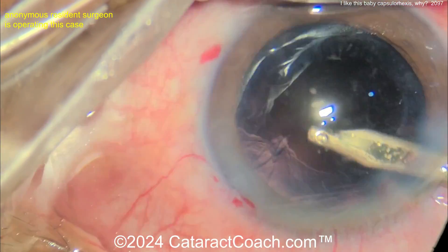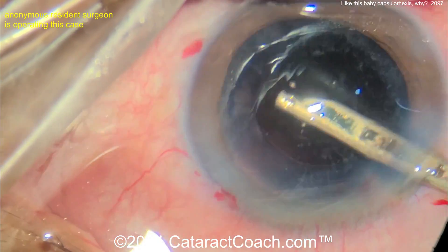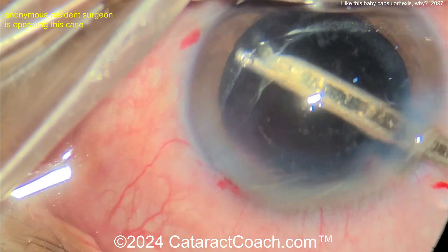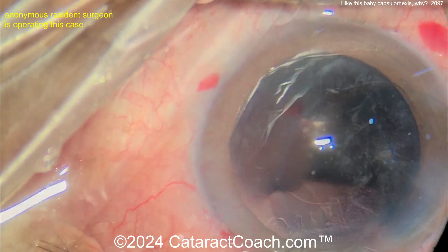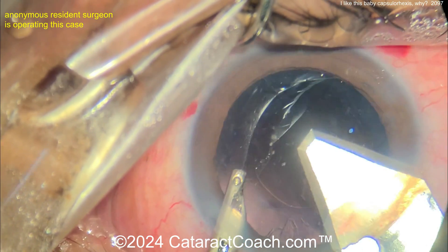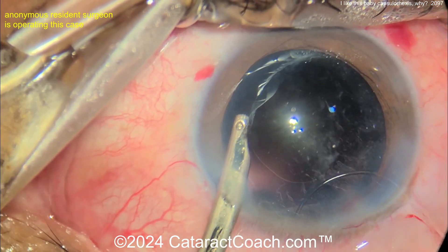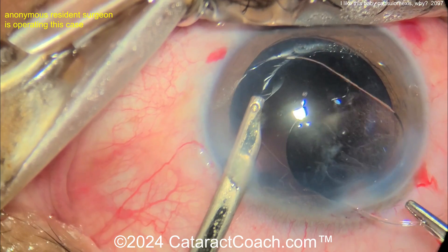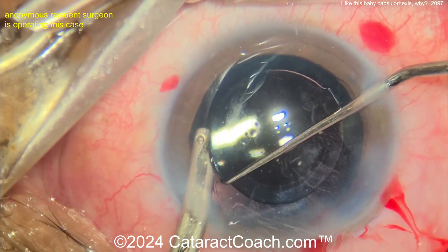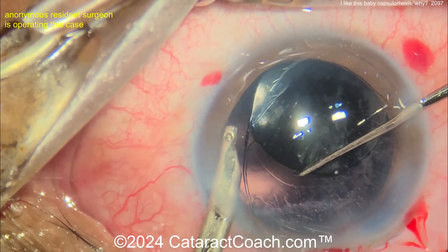Simcoe cannula going in again — maybe to access the subincisional space through that side port with the Simcoe. That's why the incision was enlarged. Now enlarging the incision even more — big blade here — so we're probably going to put in a non-foldable lens. There's a PMMA lens — polymethylmethacrylate, a non-foldable rigid lens — getting that dialed into the capsule bag. The infusion from the Simcoe keeps the eye inflated as you're getting the lens in.